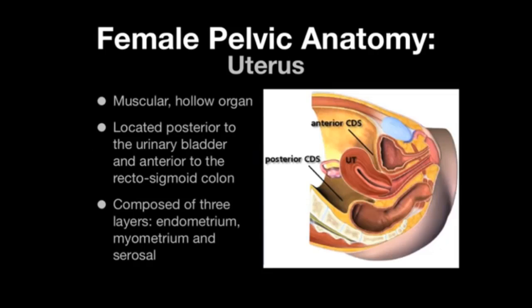Let's look at the sonographic anatomy of the female pelvis. Starting with the uterus: it's a muscular, hollow organ located posterior to the urinary bladder and anterior to the rectosigmoid colon. It's composed of three layers — the endometrial layer, the myometrial layer, and the serosal layer. The only two layers visible with ultrasound are the myometrial and the endometrial layers.